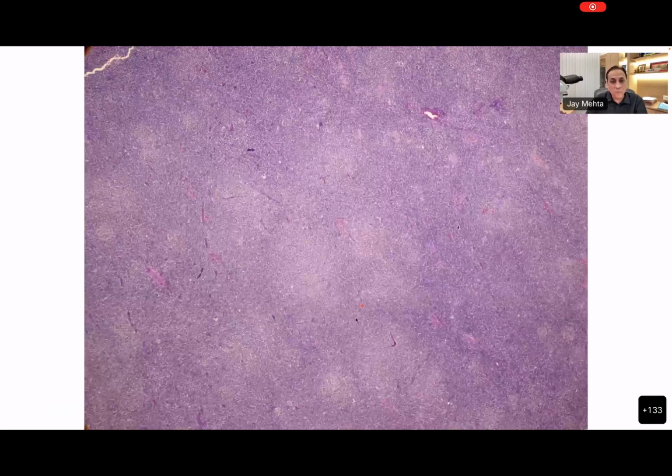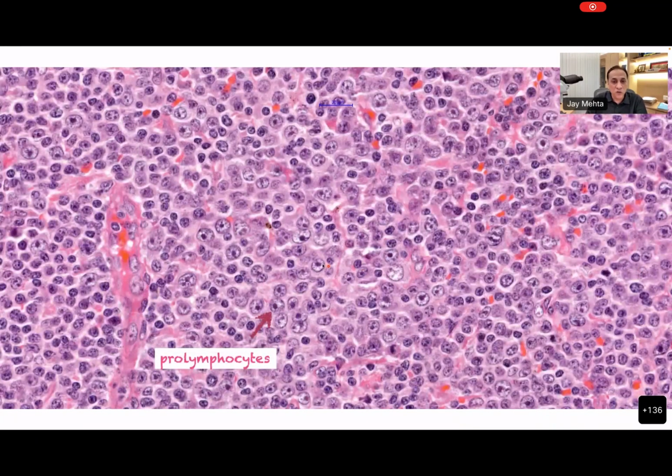And these are all pale centers. These are called proliferation centers. In this very dark infiltrate, it's dark because the cytoplasm is scant, and what you see is mostly nuclei. And what are these pale centers? They're typically associated with CLL. They're called proliferation centers, and they are full of these largish cells with prominent nucleoli.